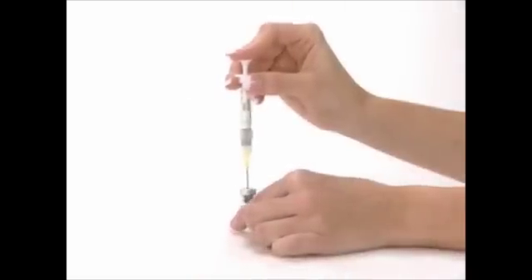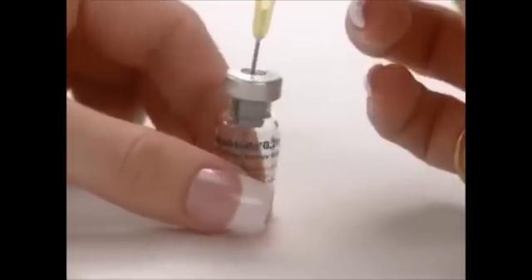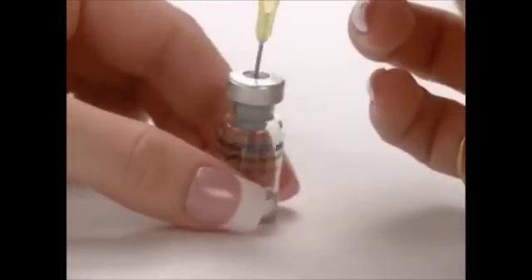Swirl the vial gently. If bubbles appear, wait a few moments for the bubbles to settle. The liquid should be clear.